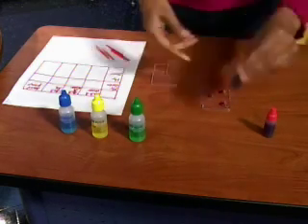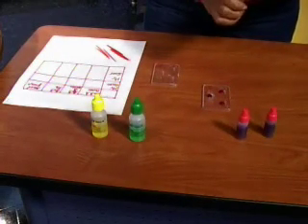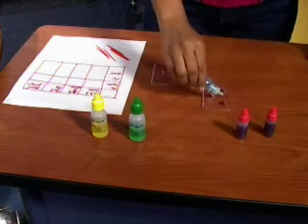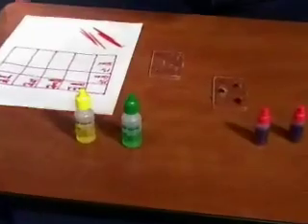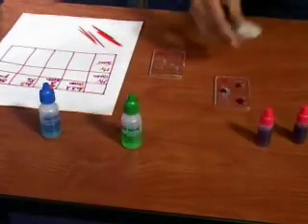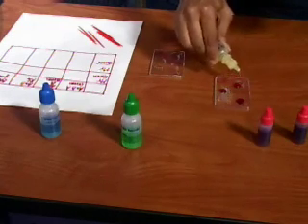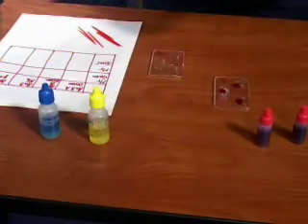Now I'm going to add the anti-A serum to the first well up here. I'm going to add anti-B serum to the second, and then I'm going to add the anti-RH to the third.